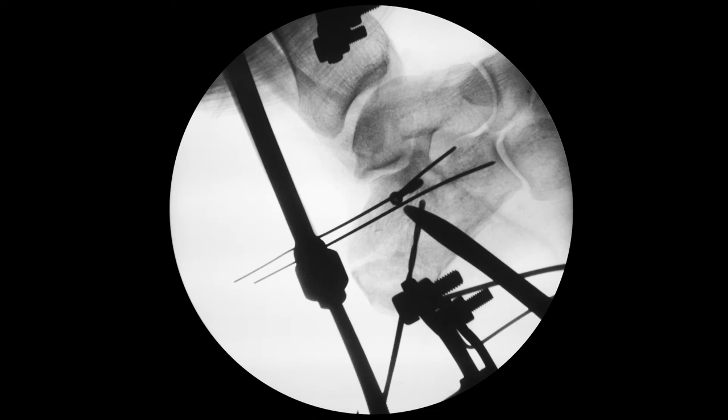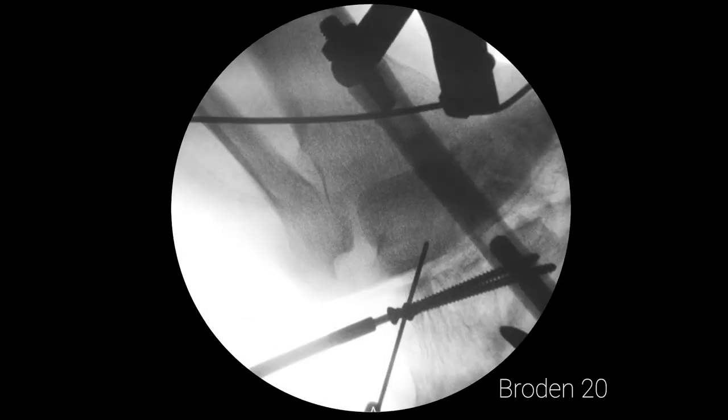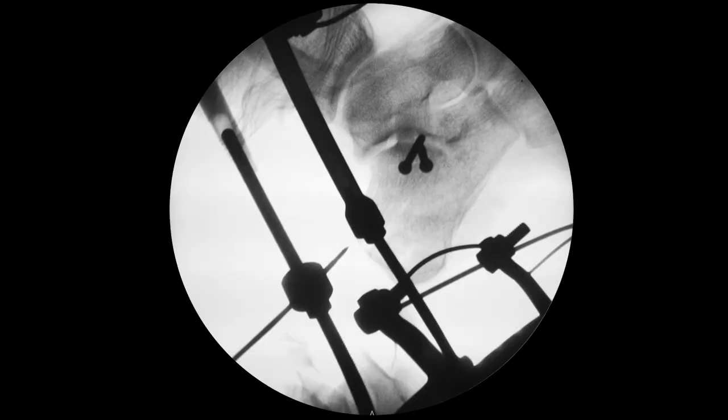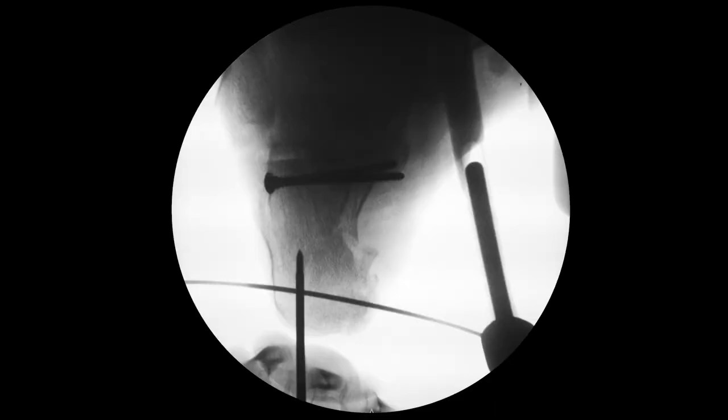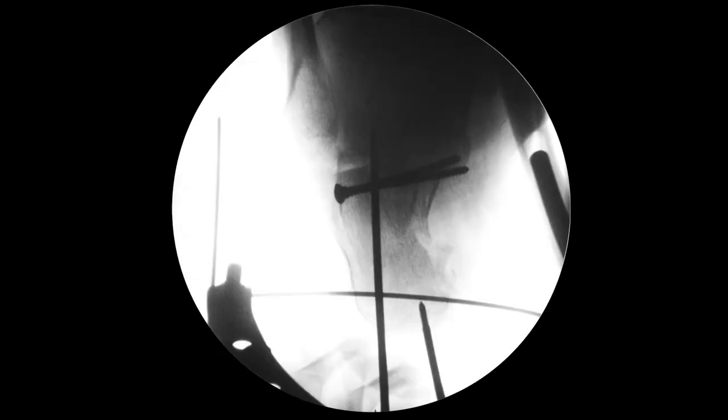After that, we inserted provisional wires subchondrally into the sustentaculum tali, reamed and installed lag screws. The lateral fragment was drilled with a 3.5 mm drill. Cancellous 6.5 mm screws were introduced using the Rodemont and Matiasic technique.